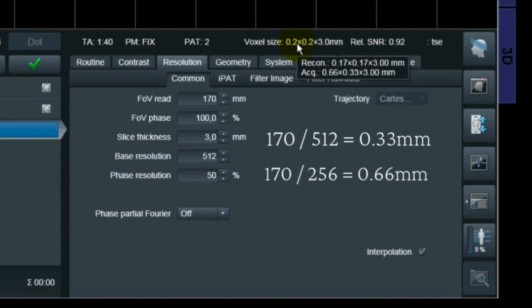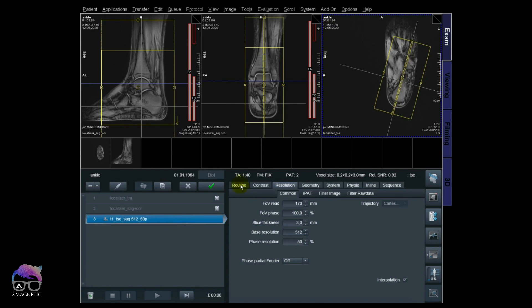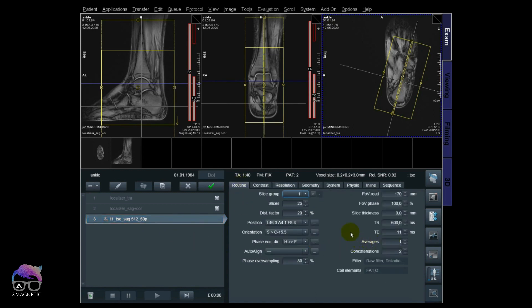Let's check this sequence. I'll name it '512_50p' so we remember it. I'll set the averages to 100 to add a little signal. Remember, I'm doing three tests here — don't think about SNR or scan time, which will be approximately the same. What I want to highlight is the resolution and the voxel sizes. Let's scan that one.